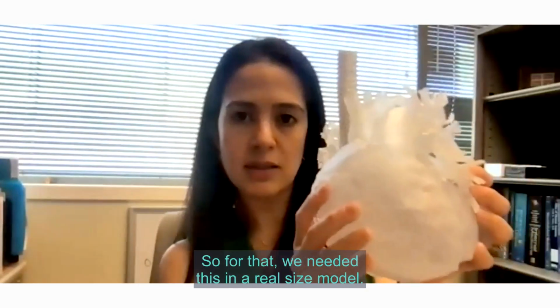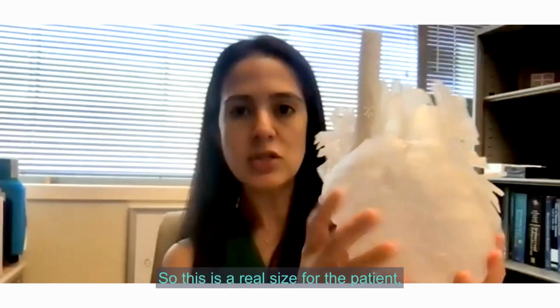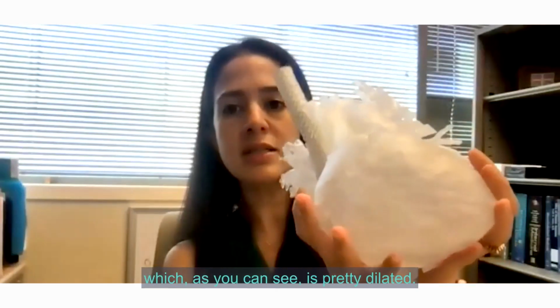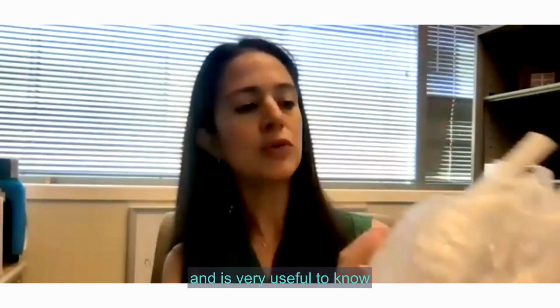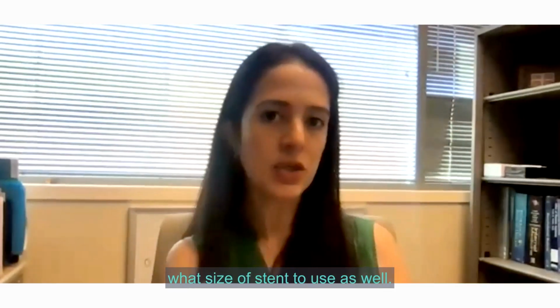For that, we needed this in a real size model. This is the real size for the patient, which as you can see is pretty dilated. If you compare with my hands, it's pretty significant, and it's very useful to know what size of stent to use as well.